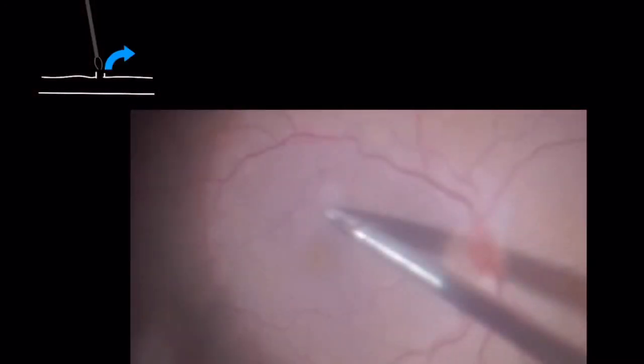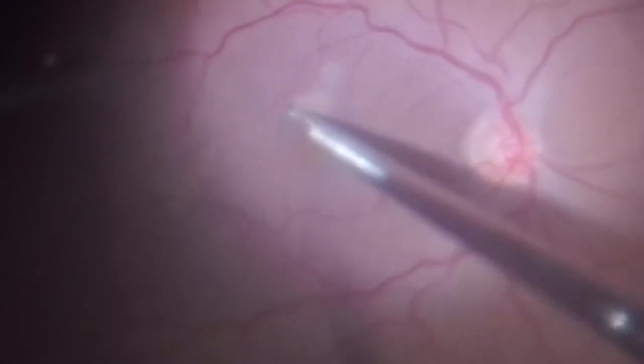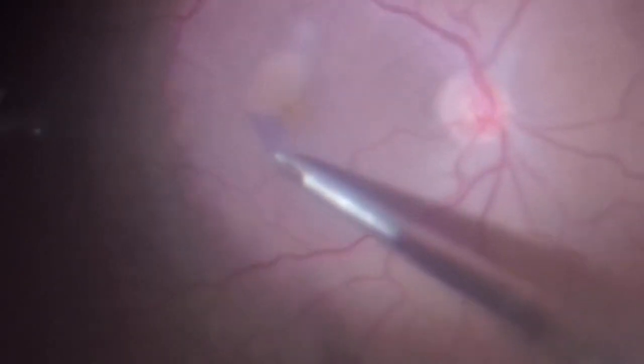You can then use the retinal forceps to re-grab the ILM at one of these edges and pull it circumferentially to complete the peeling.